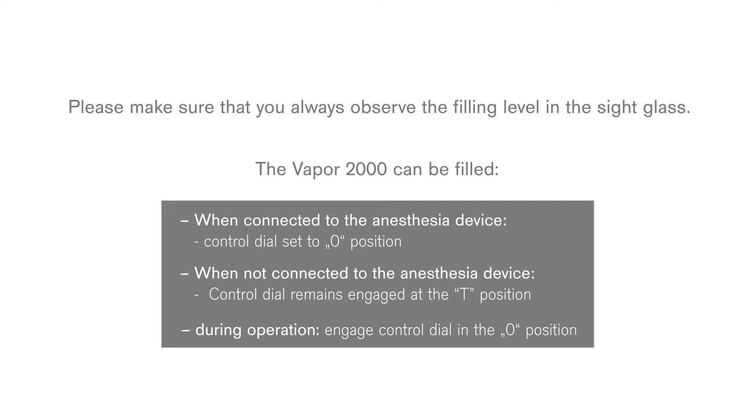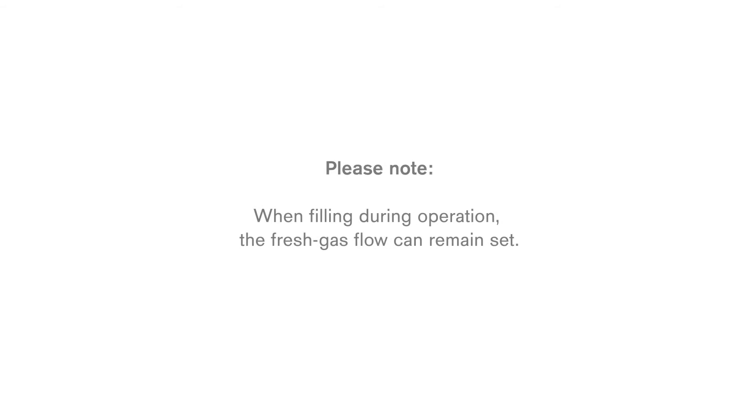Engage the control dial in the 0 position. Please note: when filling during operation, the fresh gas flow can remain set.